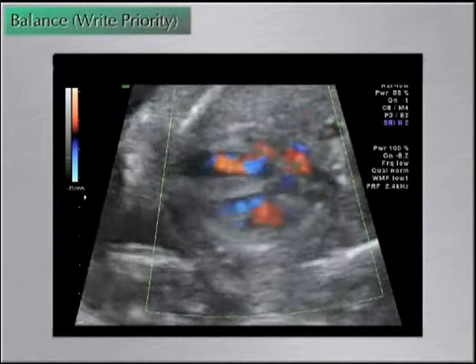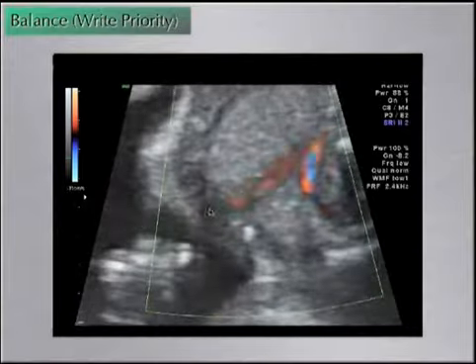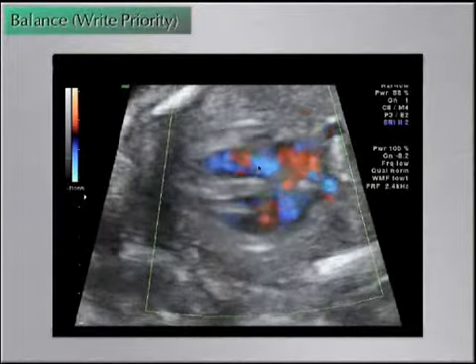This is HD power Doppler with the balance set low. Notice the interface between the blood pool and the walls of the chambers and the outflow tracts of the heart.